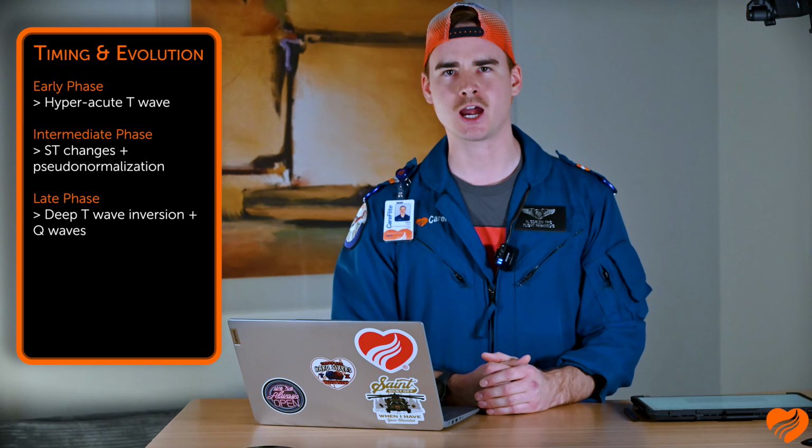Now let's look into the timing and evolution on serial ECGs. So in your early phase, which is minutes to hours, you will have those hyperacute T waves, and they will oftentimes be the first actual sign on the ECG.